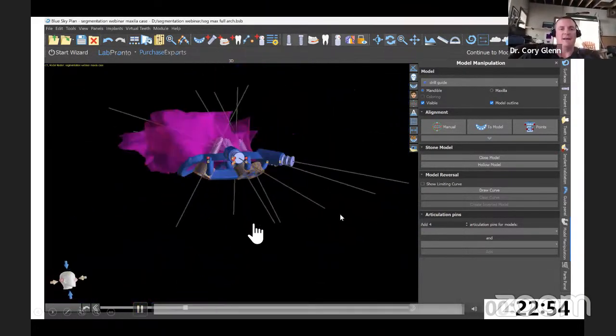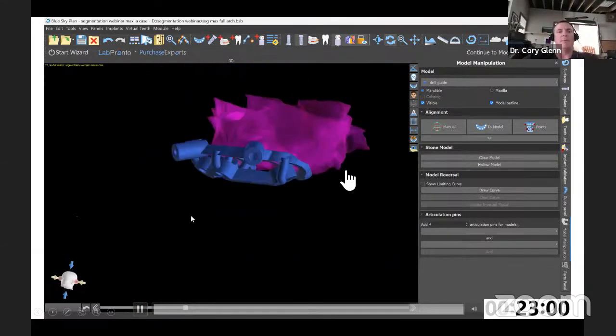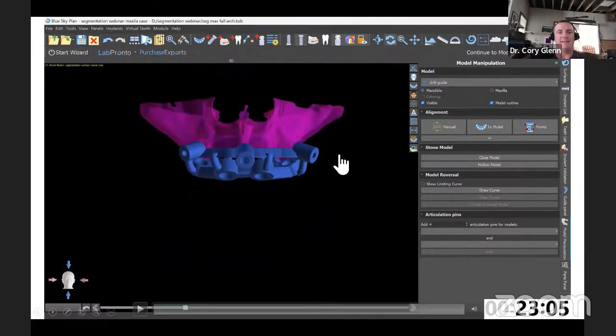So anyway, that's doing a simple swappable guide case, and that's kind of A to Z how I do that. The only thing I didn't show was doing the wax up on that, but everything else is done. So I see there's a couple of questions. You want to fire them off at me, Michael?